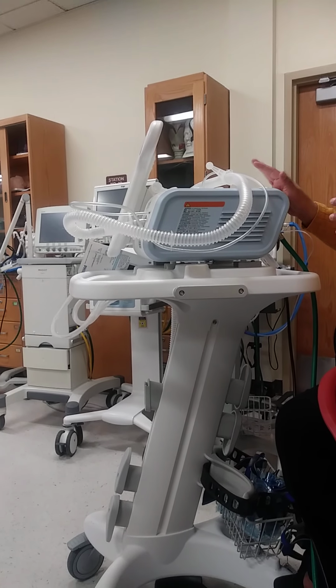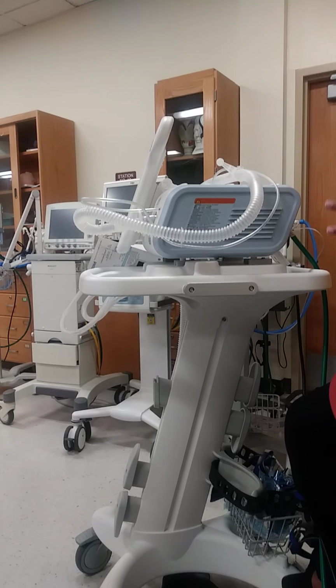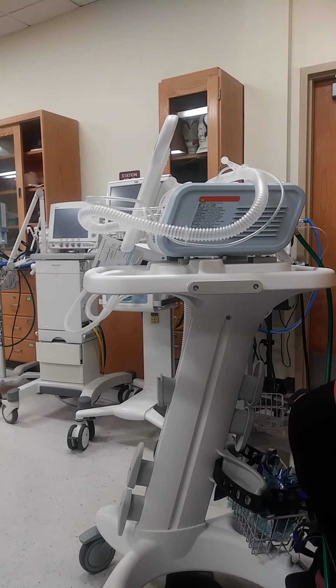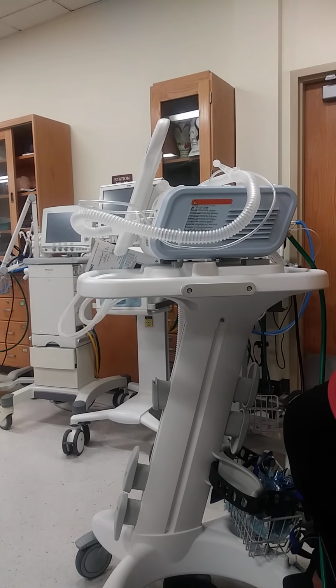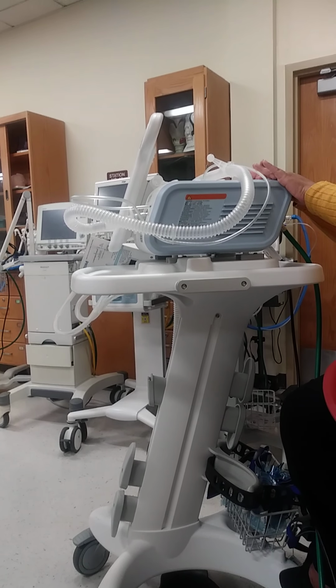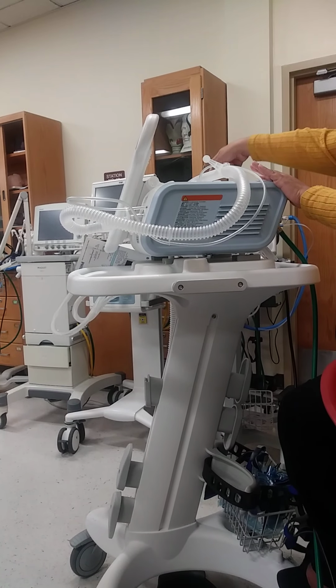Your goal is to alleviate any work of breathing or help them with their breathing. But if they can't take off the mask, if they can't follow commands, if they're apneic, if they're coughing up blood, they should not be on here. Because it's more of a risk and maybe they should be on the ventilator.